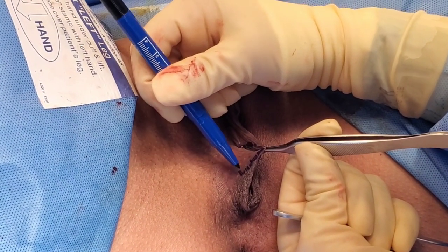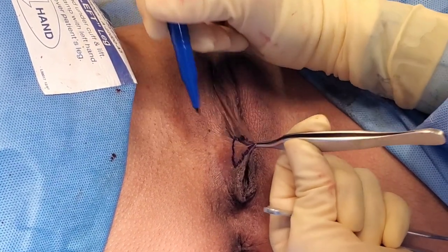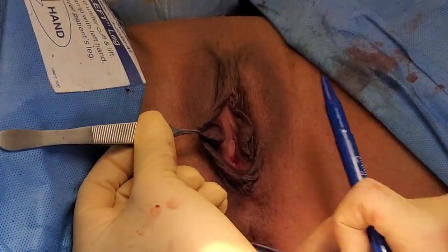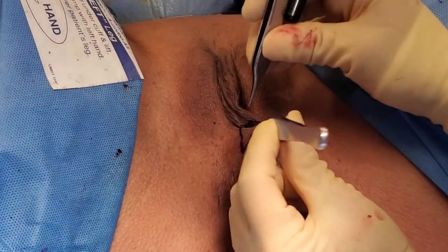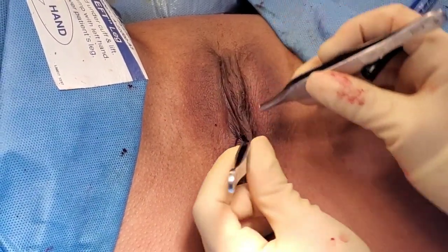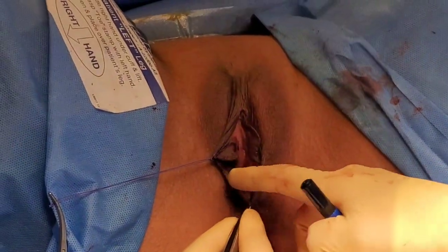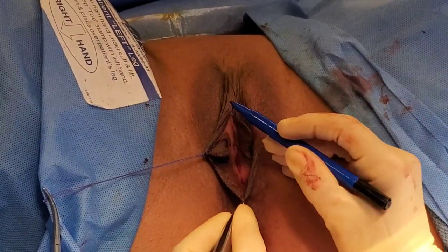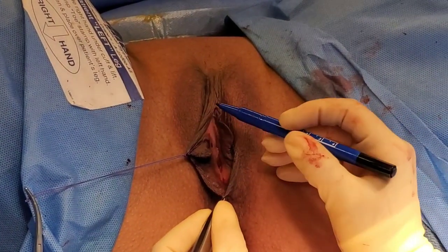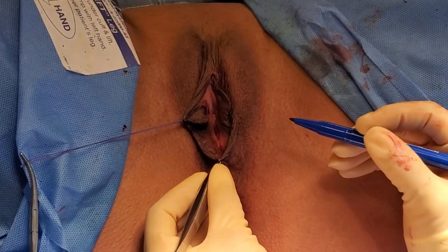I'm marking the triangle that I'm going to cut out. You can see I've marked the triangle on this side, there's the bottom edge, and I've marked it over here as well. This is the tissue that I'm going to cut out, and then I'm going to bring this top part to the bottom part. You can already tell it looks a little smaller. We're not cutting out a major portion of the labia, so the color will stay the same. Sometimes the problem with cutting out the entire labia is you get a very drastic change of color, so hopefully at the end you're not going to see very much color change.